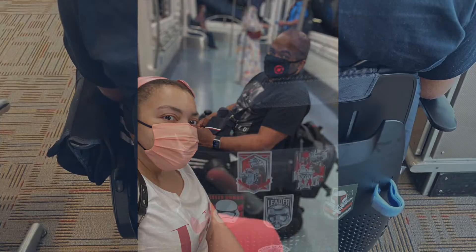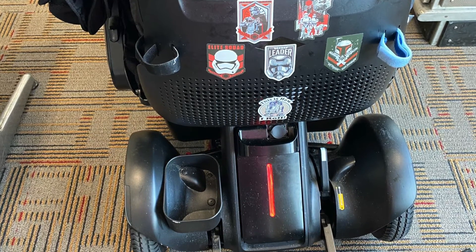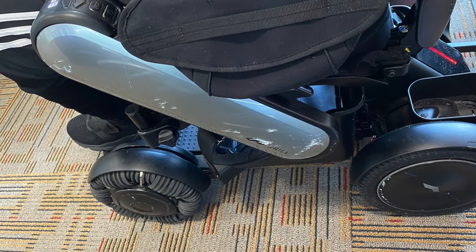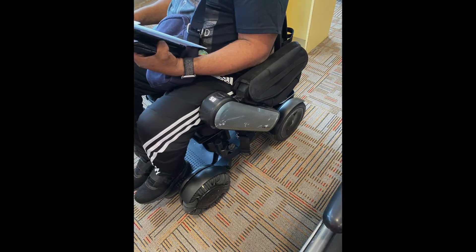Once we drop off our luggage, we go through security and get to our gate. The next thing we do is take photos of the wheelchair. You want to take new photos from several angles so you can document what damage was already on the chair and note any new damage caused by the airline. Don't worry, all of those scratches came from daily life.